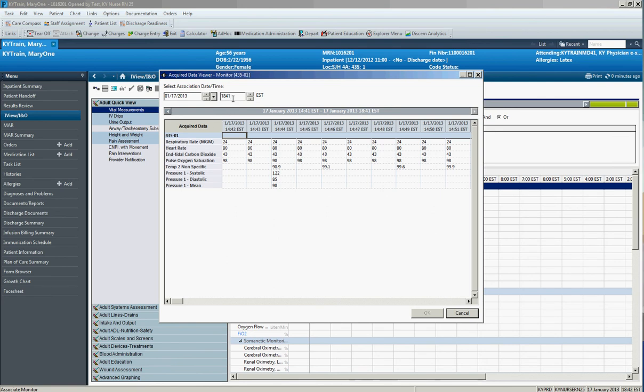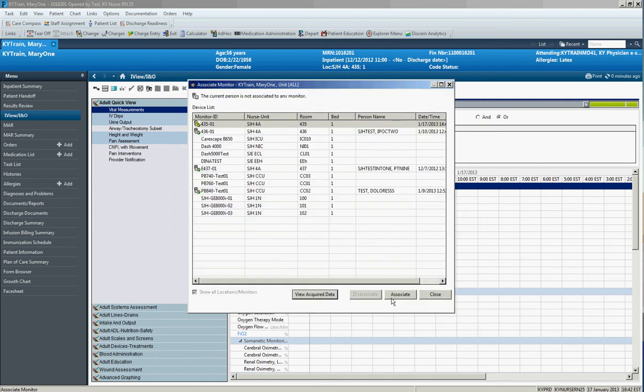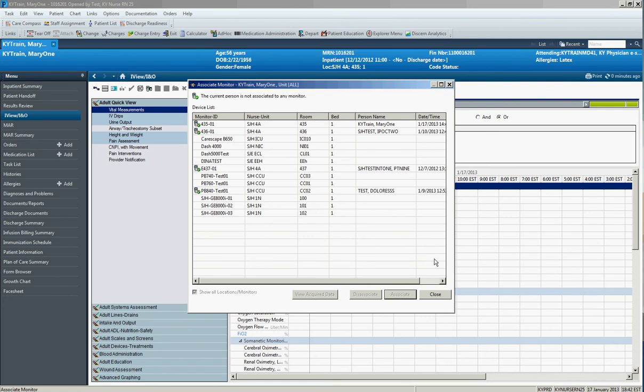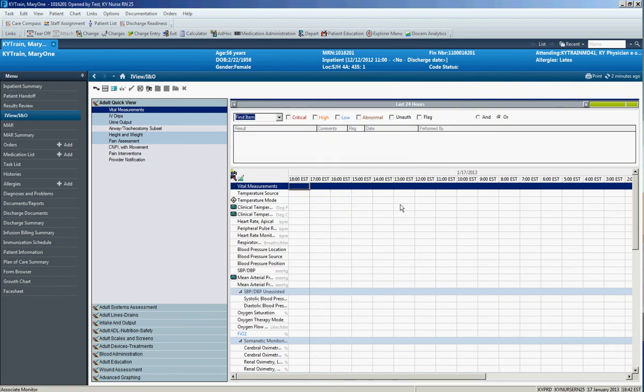So I am going to go back and say that I'm going to start recording my vitals at 14:45. And hit OK. And then I'm going to click associate. Do you want to associate this person to the monitor? And I'm going to click yes. And close. Now I'm going to go back and say insert, right click, insert date time, 14:45, hit enter. Then we double click on the column to activate it.